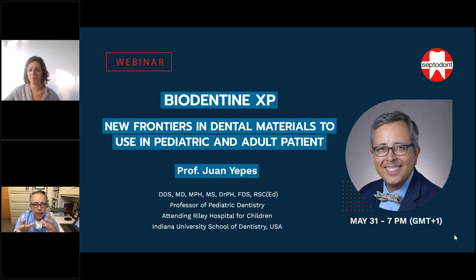I hope that the webinar was clear enough to explain that the indication of indirect pulp cap is, in my opinion, probably one of the most critical indications of Biodentine. It is the situation when you have a deep caries lesion, the patient is asymptomatic, you don't have radiographic signs that indicate that the pulp is dead, and the patient is not having spontaneous pain. That's the perfect situation to place Biodentine. It's a true dentin substitute. And also Biodentine is a true bioactive material.